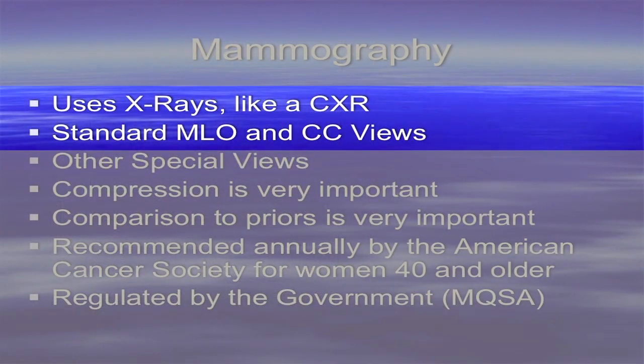But mammography, as you may or may not know, uses x-rays similar to the radiation in a chest x-ray to create images that are viewed on either film or on a computer screen. There are standard views that all women are included in, including MLO and CC.